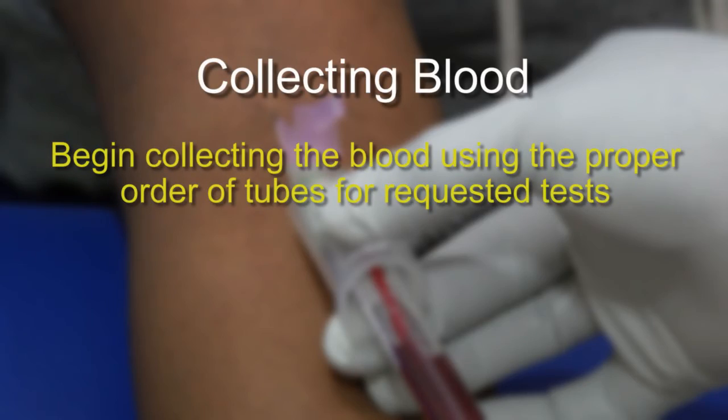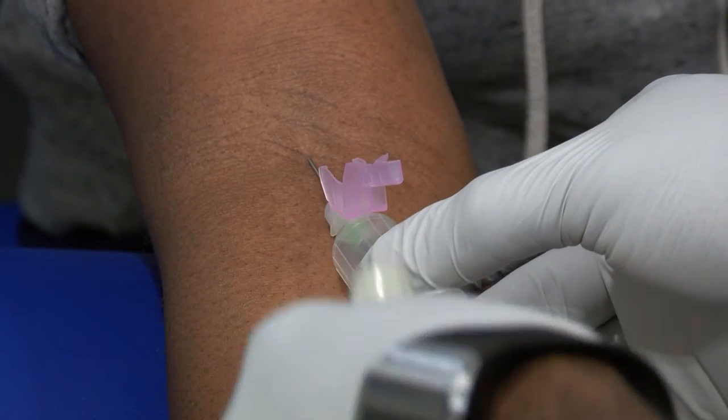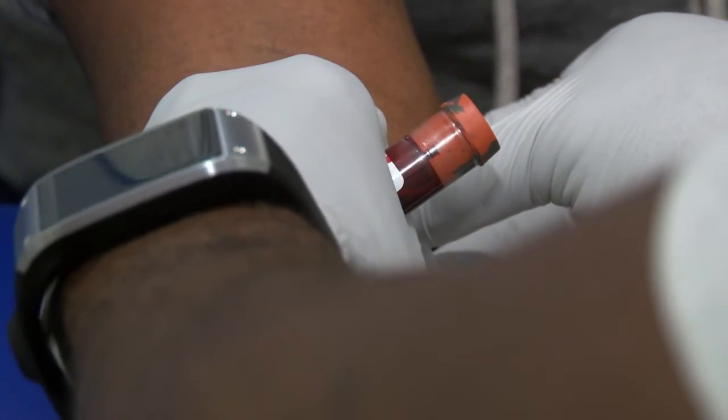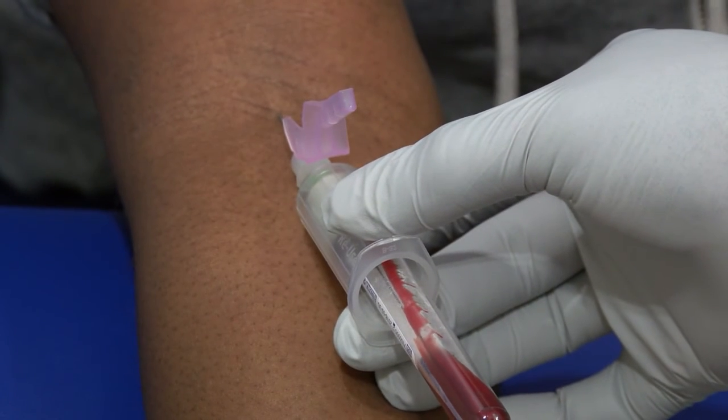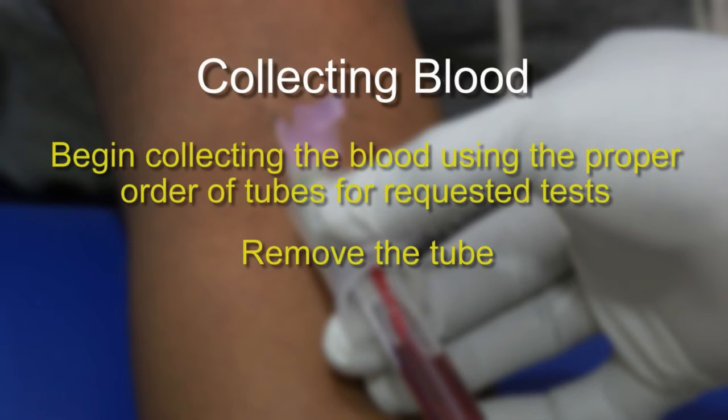Begin collecting blood. With the opposite hand, begin collecting the blood using proper order of use of tubes. I'm going to do the twist to change. Okay. Remove the tube.